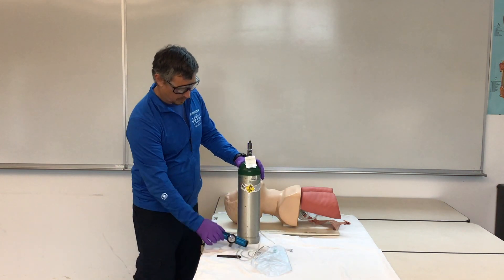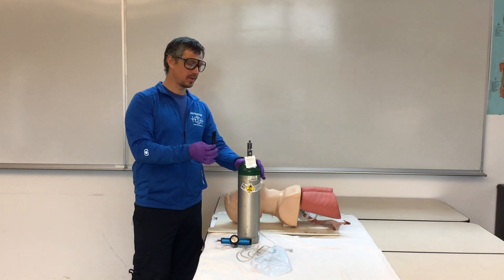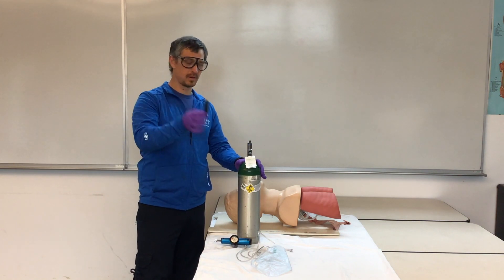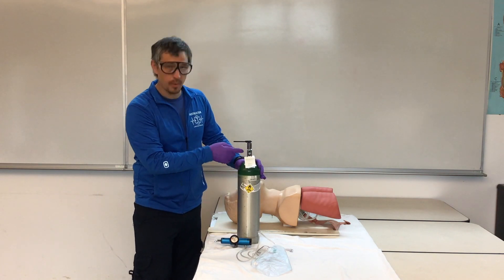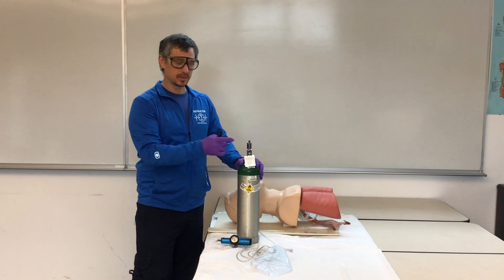With the oxygen tank, we're going to have our oxygen wrench. We can use it on the top of our tank — that's how we turn it on and off. We'll slip our oxygen wrench on top and crack the tank to make sure that the opening is clear, so any debris has been blown out.